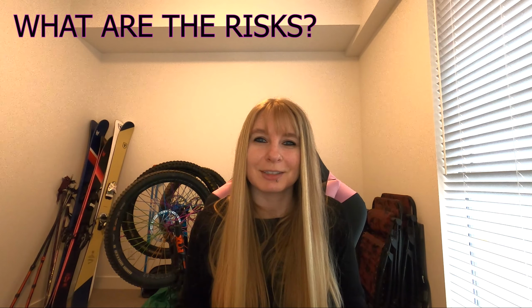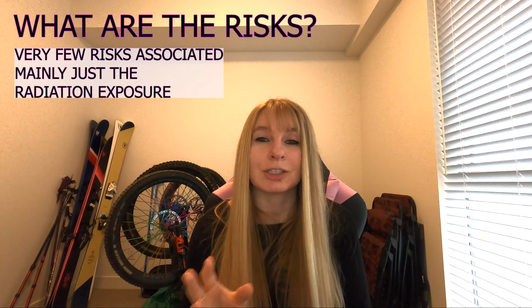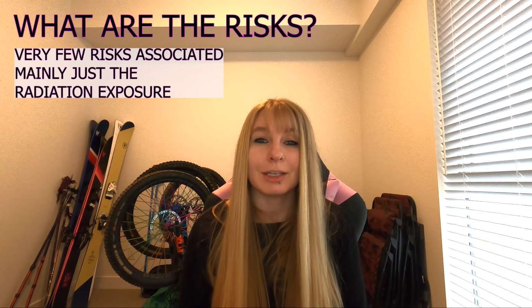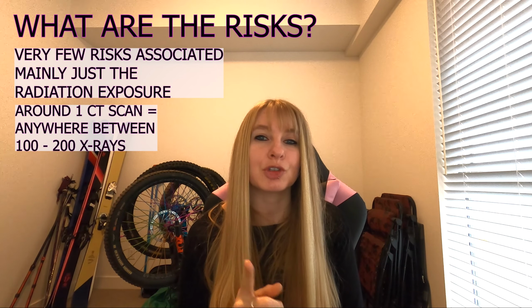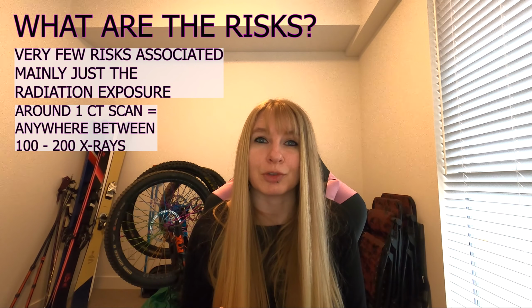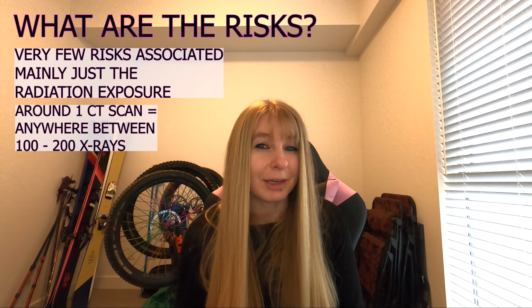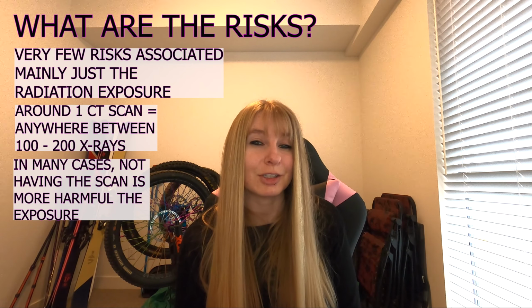So what are the risks? The risks associated with CT are very few. The main thing is just the radiation exposure. It is reported that around one CT scan can be anywhere from between 100 to 200 x-rays, but doctors will always weigh up the risk before ordering one or doing multiple. In many cases, not having the scan can be more harmful than the radiation exposure.